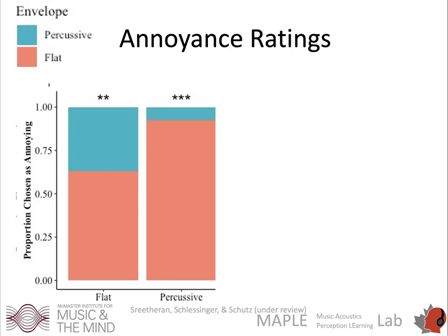That's a really important outcome because we're not seeing any difference in memory, and in previous studies we found they're no more difficult to learn, and in some cases the percussive sounds might even be easier to associate with certain other things. So what this is saying is that it's possible to dramatically lower the annoyance for both patients and for medical professionals by changing these envelope structures, and it seems like we can do that in a way that doesn't harm the things that are good about the alarms, their communicative value.